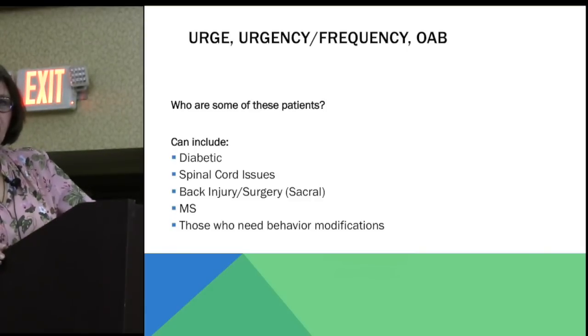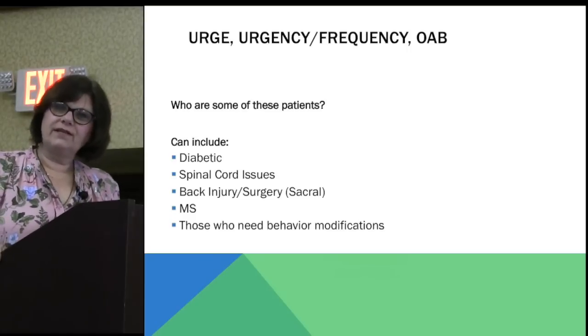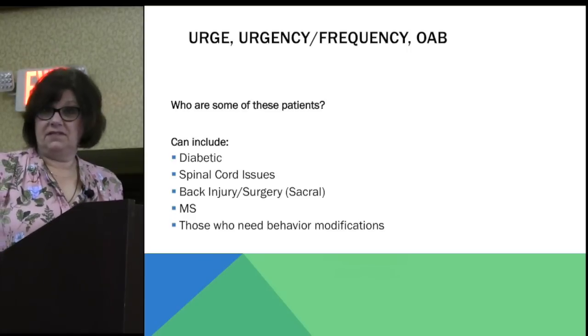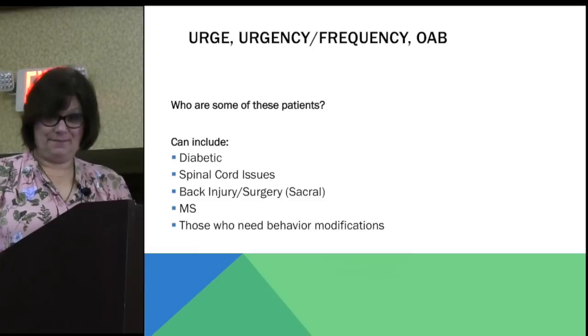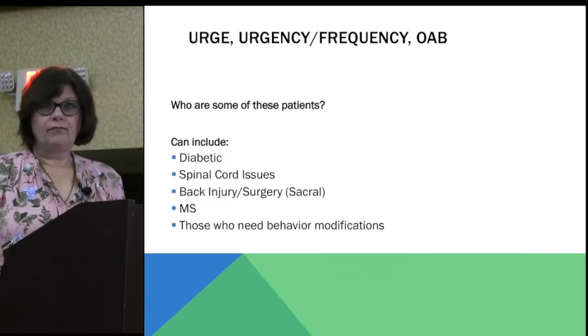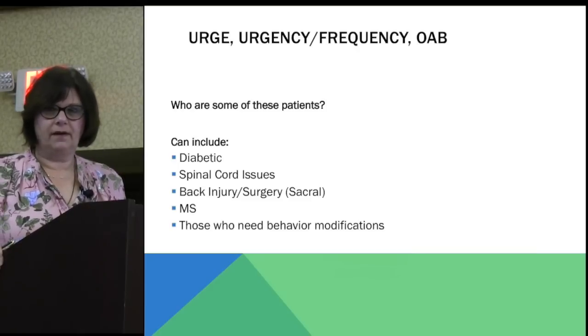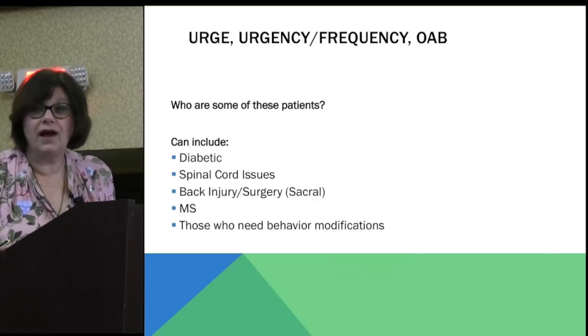During the test itself, you mean do the quick clicks? Yeah. I usually don't, but that's not a bad idea. That is something I teach them about after the fact, because that's your perfect patient usually to do that. But I've always found that I like the slow infusion. That usually helps quite a bit. That's my reason for doing it, but that would definitely work, or at least you could try it. You can try it for sure.